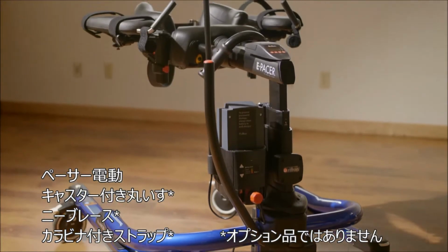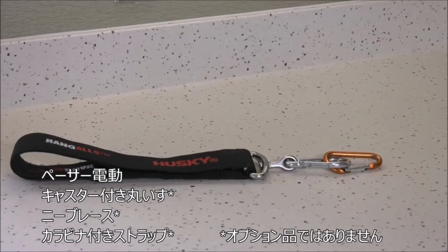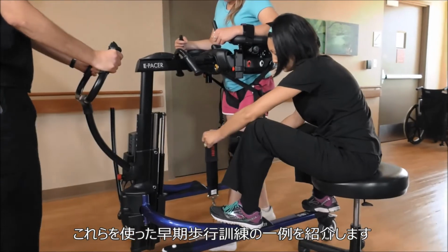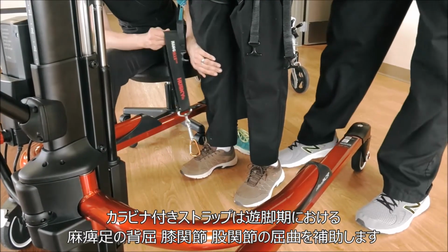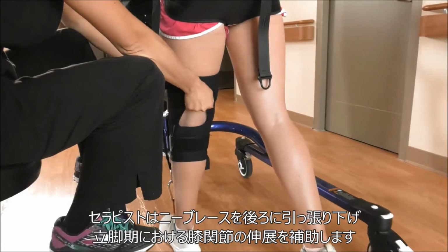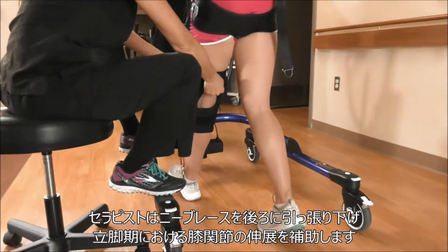With the Rifton e-Pacer, a rolling stool, a knee brace, and a strap known as a Husky hang-all, which contains a carabiner, a patient can overcome these obstacles and begin walking much sooner. The Husky hang-all facilitates dorsiflexion, knee flexion, and hip flexion on the weak side during swing phase. The therapist pulls back on the knee brace to facilitate knee extension during stance phase.